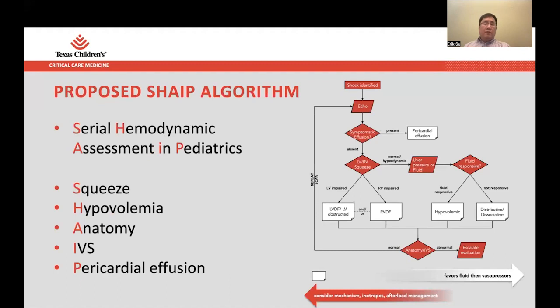To start off, the general paradigm for what we're going to be talking about. We here at TCH teach looking through everything in a protocolized manner, in terms of the various parameters you're identifying within the cardiac imaging, so that you have a good survey of what's going on, and you hopefully catch things that should be a natural checkbox, and otherwise help compose an organized way to approach the imaging that you're obtaining.